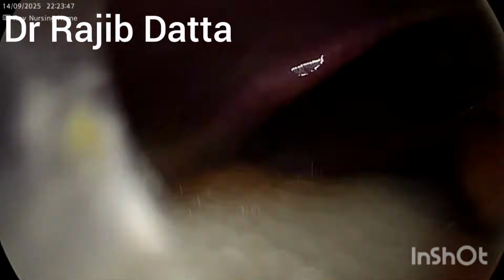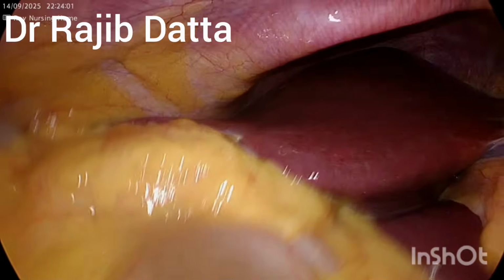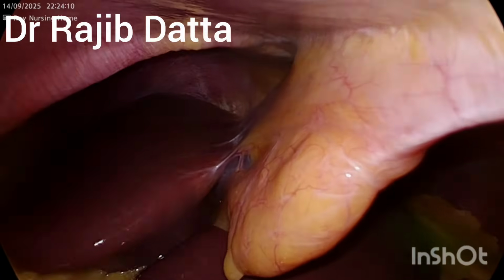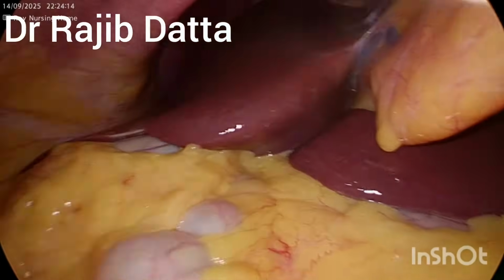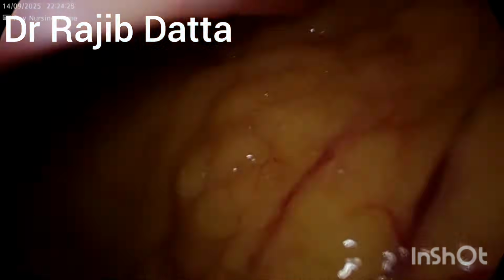This is a case of laparoscopy in a patient suffering from type 2 diabetes mellitus with hypertension. The patient has a previous history of emergency OT cancellation due to high sugar and blood pressure. Now, after stabilization, the patient is planned for 3-port laparoscopic cholecystectomy.